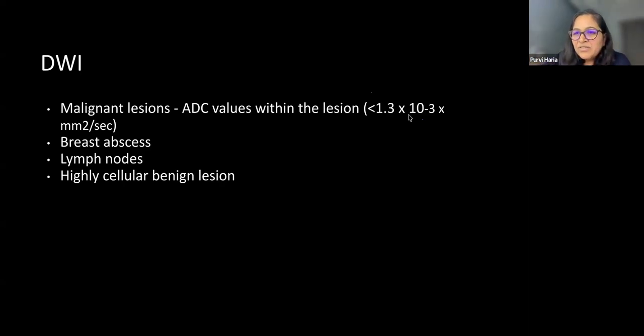There are a lot of studies exploring the use of ADC as a screening modality in breast cancer, whether we can replace contrast for these patients and just do a good diffusion. They measure this ADC value, and it gives an idea about the nature of the lesion.